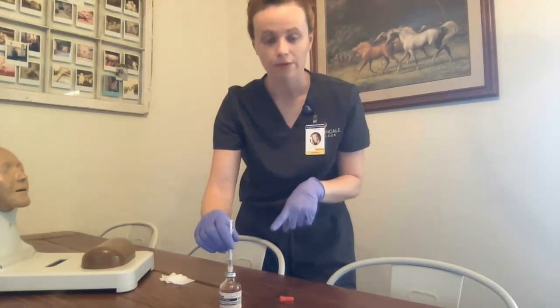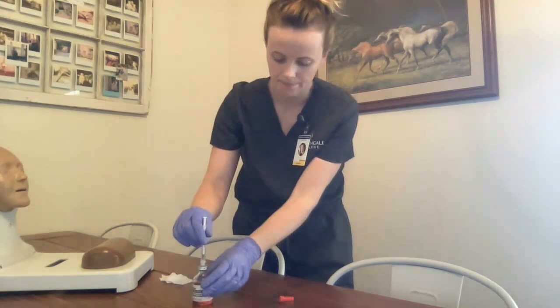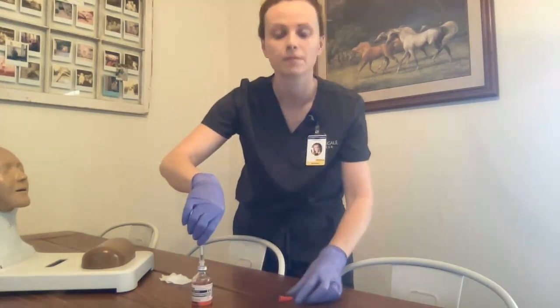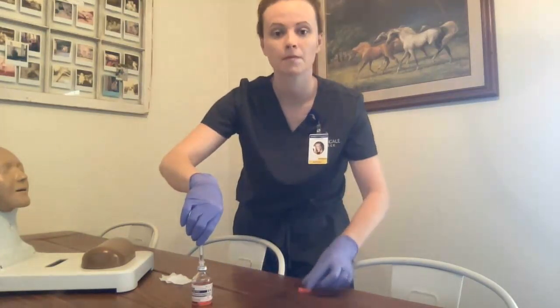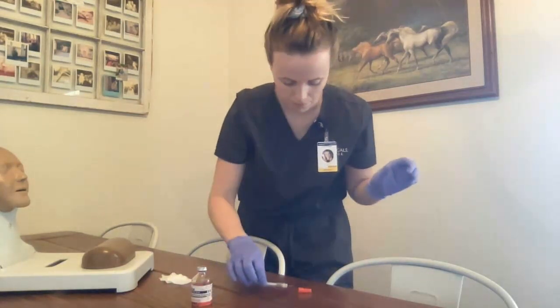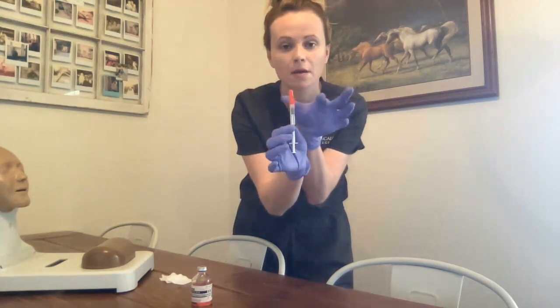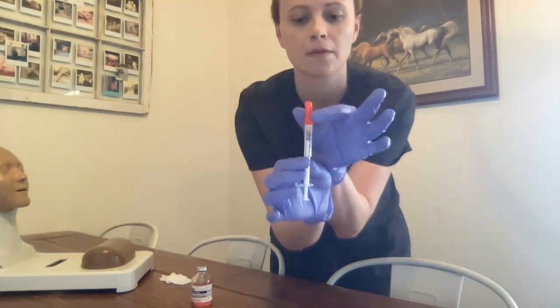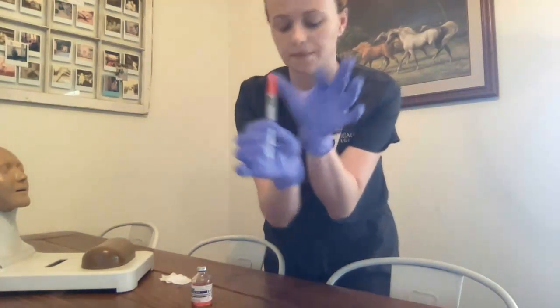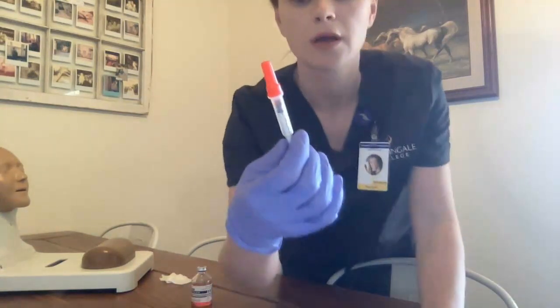After removing the needle from the solution, I need to recap it using the scoop method — just like that. My medication is ready to go, again at 0.1 milliliters.